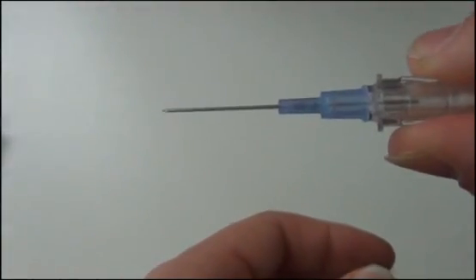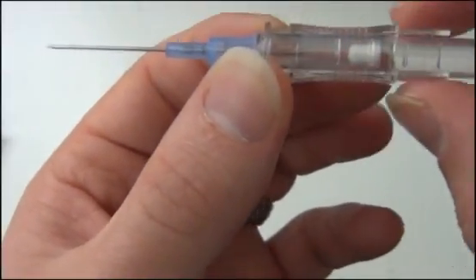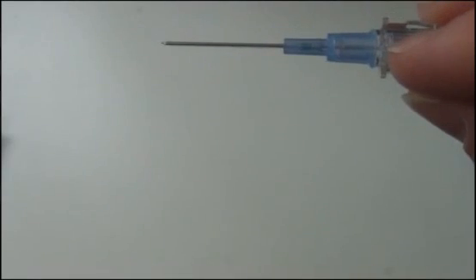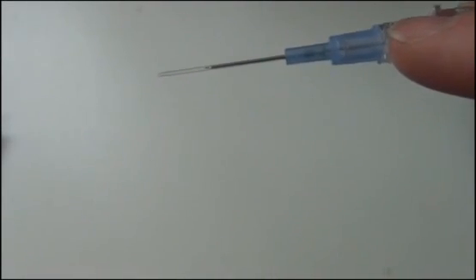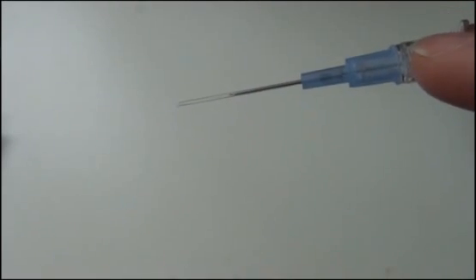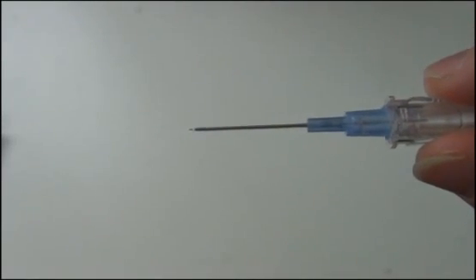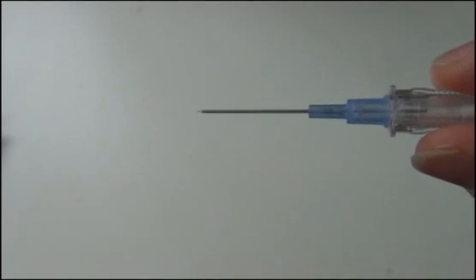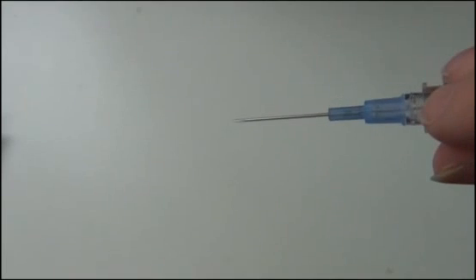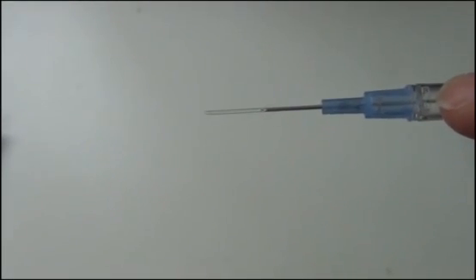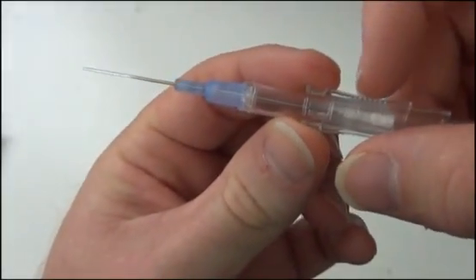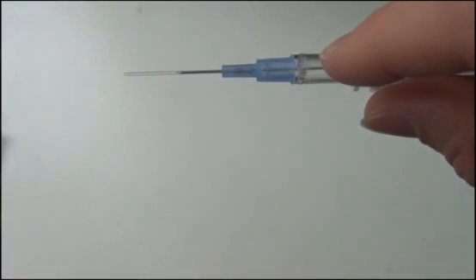So once you're inside that vein, you're going to hold the extender piece right here completely still. And you slowly push here and advance this into the vein. So what you can see there is that needle's not moving anymore, and I'm slowly advancing that catheter into the vein. So this really takes some finesse, some practice, it's not going to come immediately, but with practice you'll kind of get a feel for how to know when you're in a vein, how to know when you're in a good vein. You should continue to see flashback. This whole chamber here, if you have a really good stick, this is going to completely fill with blood. And this should advance easily if you have a good stick.